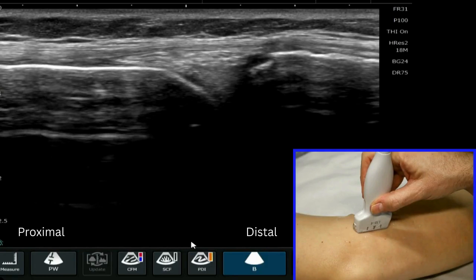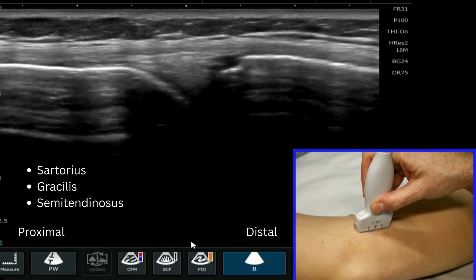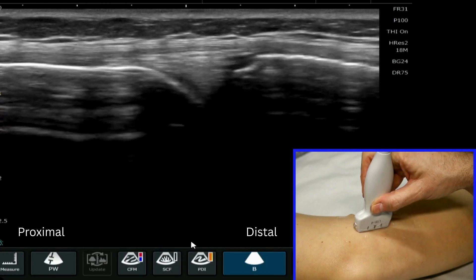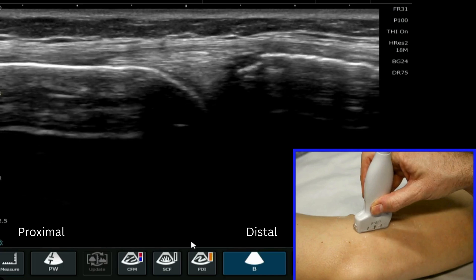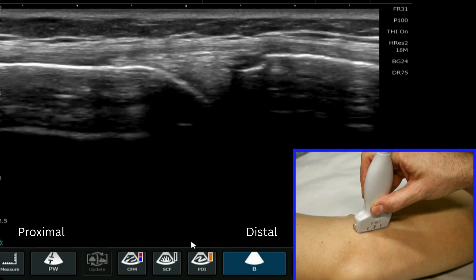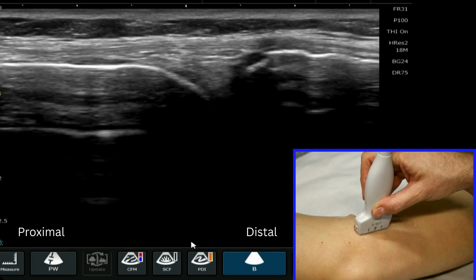For this video tutorial we're going to consider the distal insertion of the pes anserinus tendons. These are the tendons of sartorius, gracilis, and semitendinosus. I like to start this evaluation at the medial aspect of the knee, medial joint line. It's just a nice landmark and reference point to begin this examination.